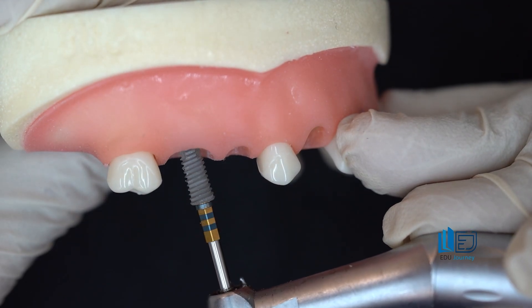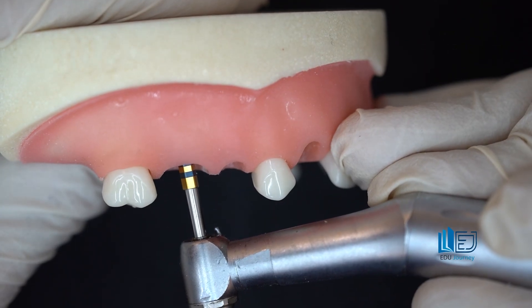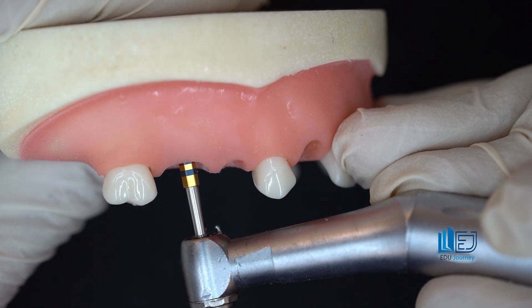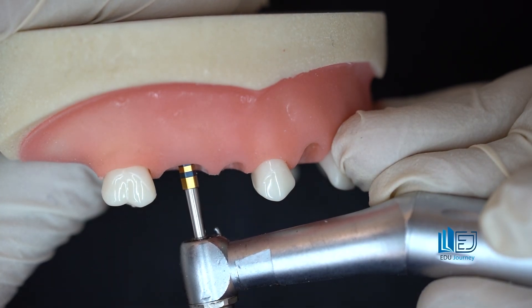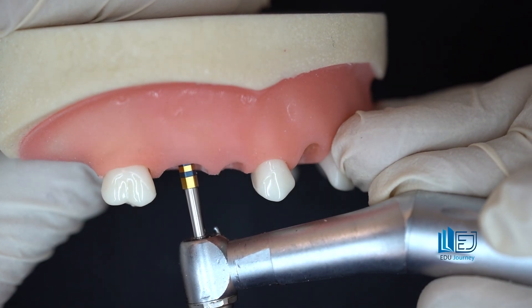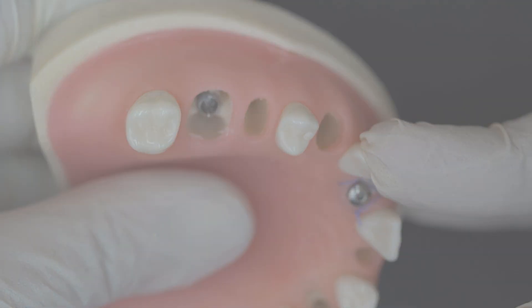The depth at which the fixture is placed is very important; we follow the same principles. There are three indicators: 4 millimeters from the free gingival margin and 2 millimeters from the healthy buccal bone crest indicates proper implant depth. Also, the furcal bone 2 millimeters below the healthy buccal crest serves as a good indicator. The implant platform should be at the level of the furcal bone, 2 millimeters below the healthy buccal bone crest, or 4 millimeters from the free gingival margin. These were the key points for fresh socket implant placement in the posterior regions.